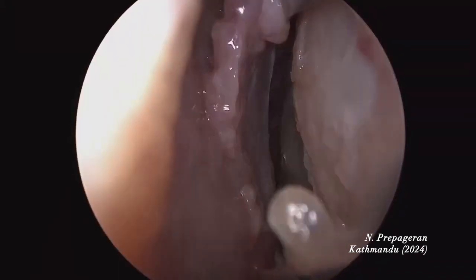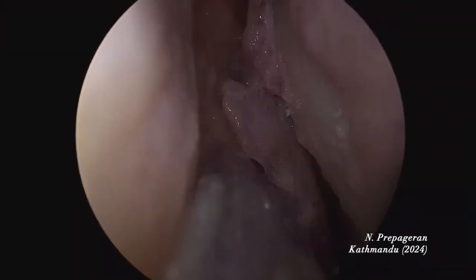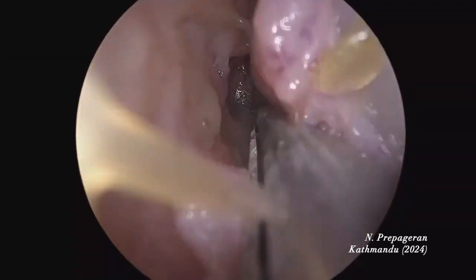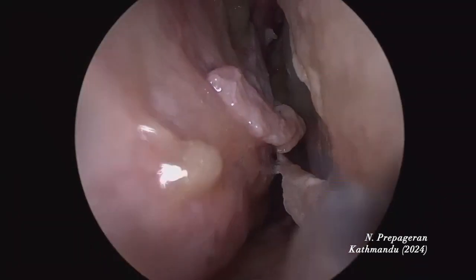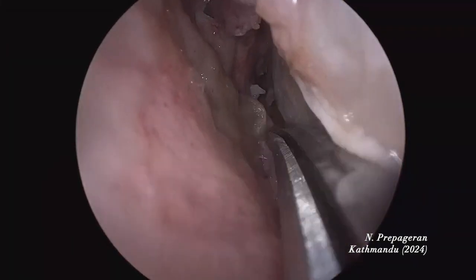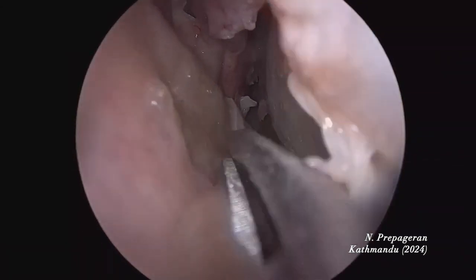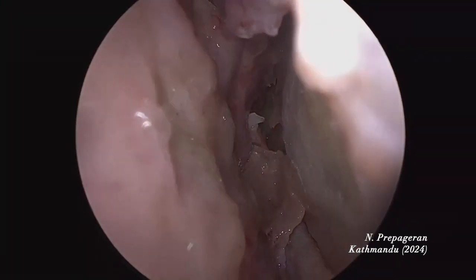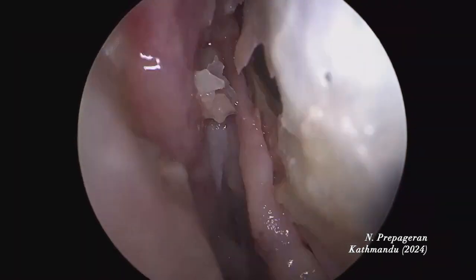Instead of using scissors, we're going to use a true cutting instrument — the head and neck scissors, which is fine. You just have to use whatever is given to you. Life is not about instruments; life is about making do with whatever you were given. Now I'm cutting the flap inferiorly and superiorly, giving us the flap raised all the way back.